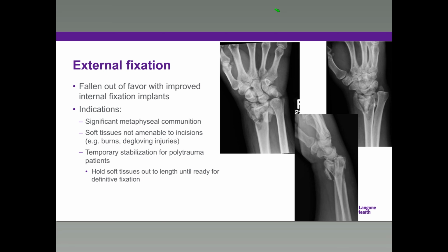Also, if you have an injury where the soft tissues are just not amenable to incisions, like burns or degloving injuries, then you are also going to be better off with an external fixator. And sometimes we'll just use it for temporary stabilization for a polytrauma patient.